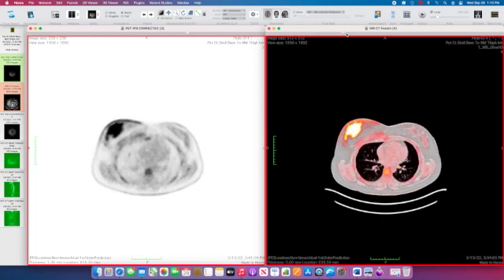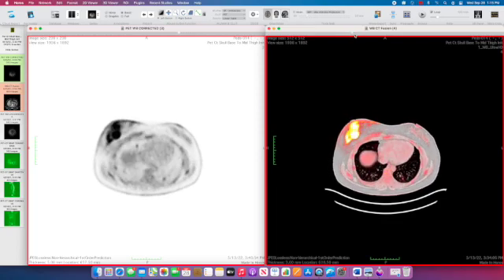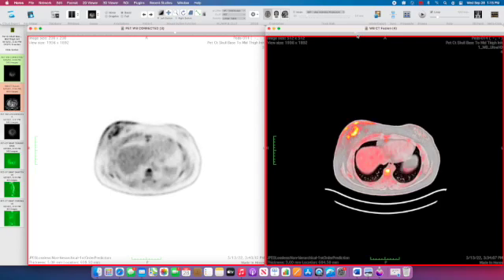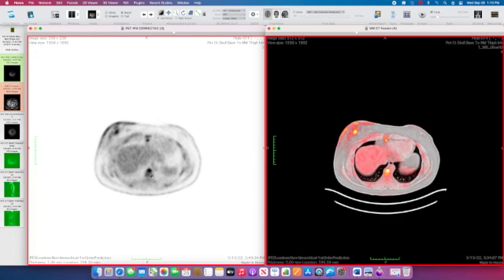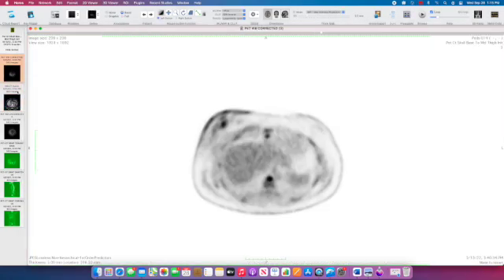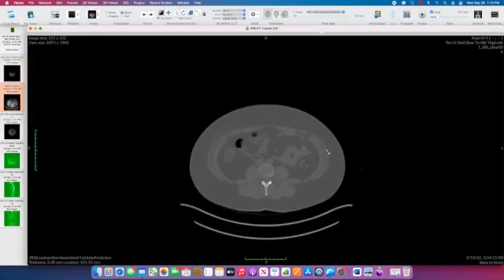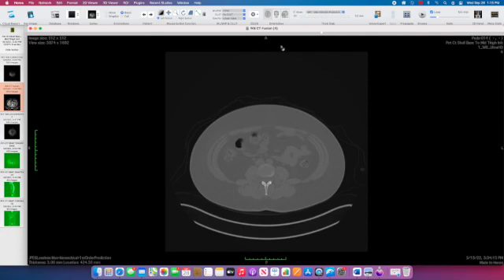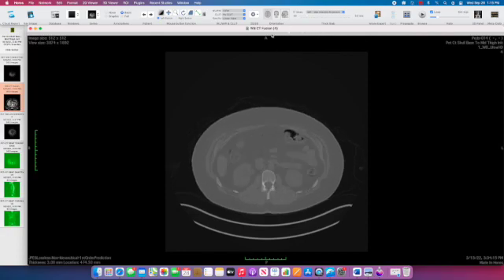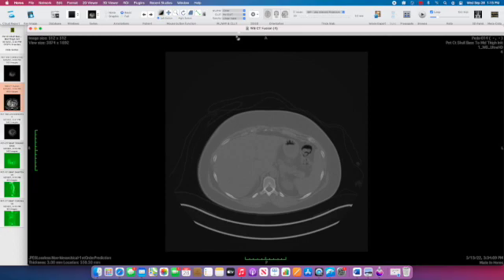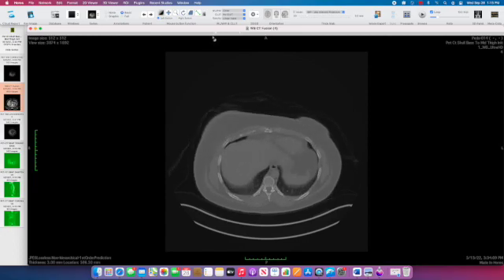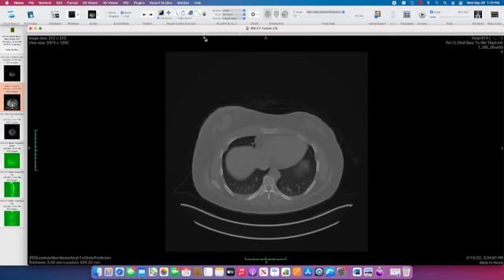A slightly more subtle finding: there's some physiologic activity in the bone marrow, but there are also areas that are clearly more intense. In this lower thoracic vertebral body, there's an intense focus of radiotracer activity. The CT findings for this lesion are pretty subtle, but there is a small lytic lesion in that lower thoracic vertebral body. So this patient also, unfortunately, has bone metastases.